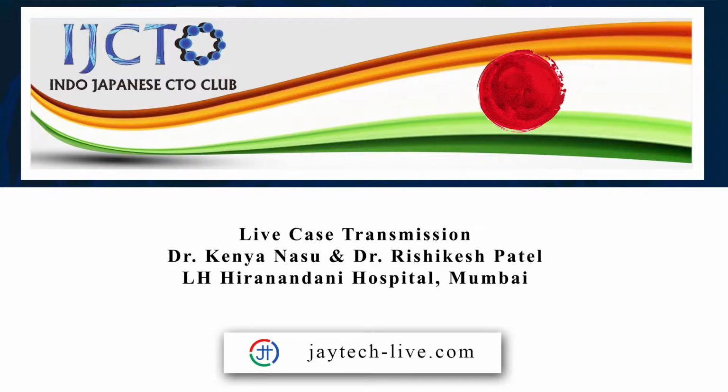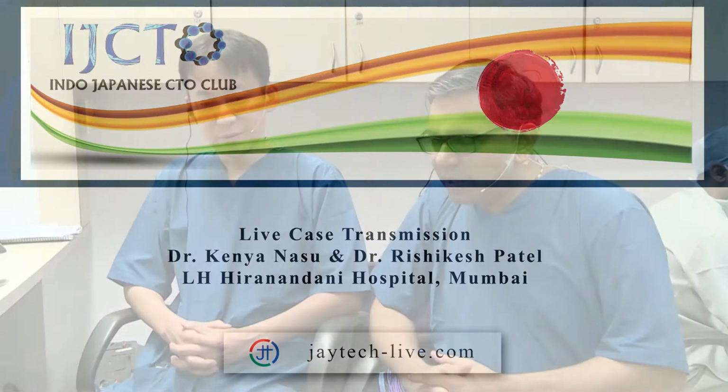Yeah, good afternoon. Myself, Dr. Rishikesh from Hiranandani Hospital, Mumbai, and with me is Dr. Nasu. Actually, the live case, which was supposed to be live telecast, we finished much early, and there was another primary angioplasty case. So we have been discussing the case with everything already ready with us. I will shortly cover the history.